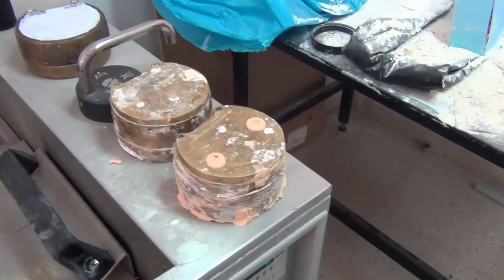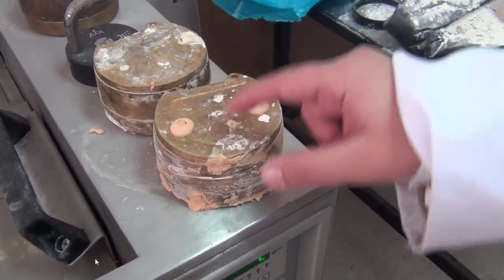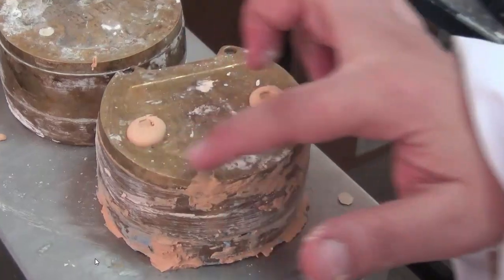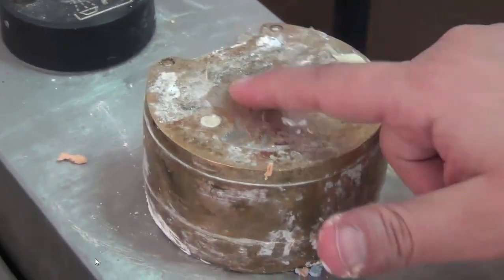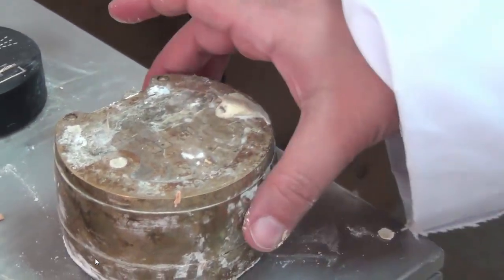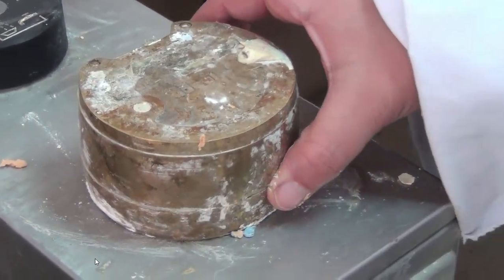Now you have finished the flasking procedure, and this is immediately after flasking. You can see that the excess material went out of the vents around, and this means that this flask is fully filled with the layers. Once you clean this, we get the flask with the whole flask closed, and inside we have the cast, the wax, the teeth, and the layers of plaster, stone, improved stone, all embedded in here.